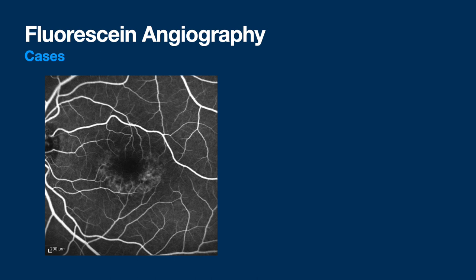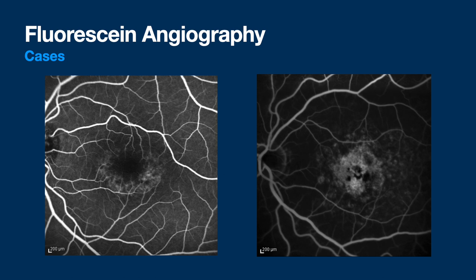Here's another ABCA4-positive patient — similar appearance but with more central involvement, more staining, and look how dark the background is. It's quenched — this is more the typical Stargardt presentation with a dark choroid. However, it's actually not as common as we used to say. Now that we can test everybody for Stargardt, we're finding a lot more people have it than we thought, and dark choroid is not nearly as common as previously believed.